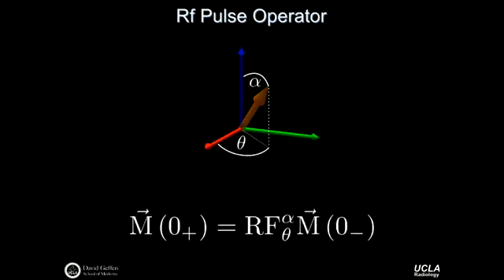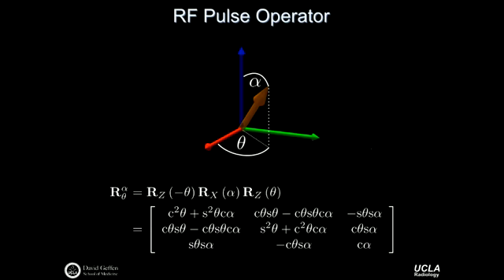It's just a trick of mathematics, meaning the change of basis here is just to say I need to tip by alpha, right? And in this coordinate system, I'm tipping that way. But if I had a different coordinate system, it's just a change of basis. My flip angle only tells me how far I've moved away from the z-axis, whether I've moved this way 90 degrees or maybe I've gone this way 90 degrees. The change of basis makes sure that you're always moving along the same, call it x prime direction, and then when you're done, you rotate it back to the x direction.